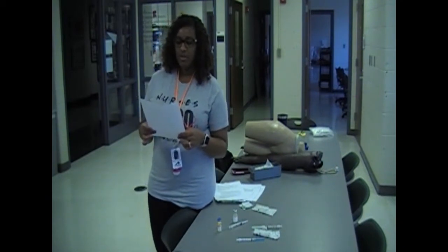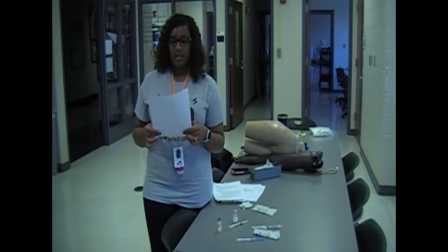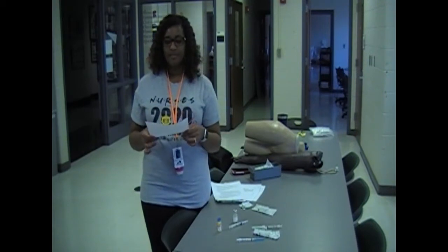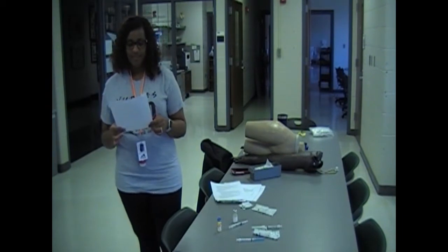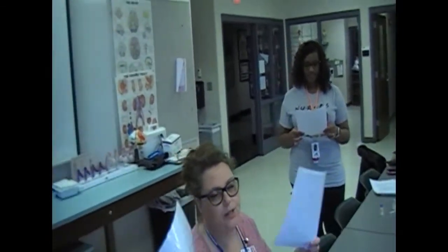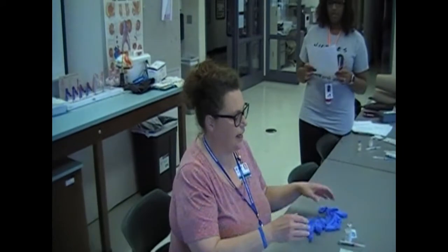So as always, you want to perform your hand hygiene and compare your orders, and then we start our first med check. All right, ready, Miss B? Yeah, I'm ready. Awesome. So like she said, you're going to compare your orders. Hand hygiene.